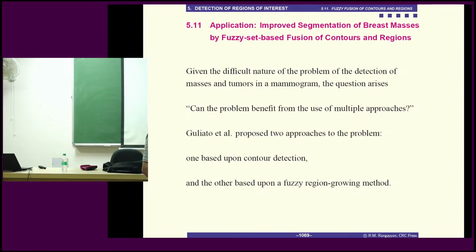No, but we were looking for straight lines only in the Hough transform case. In this case, we put other conditions that these lines must cross the upper boundary and the lower boundary. The lines that you get within the breast will be short lines, so they will all be rejected. I showed some of them that passed the test, but they will not be as strong as the pectoral muscle edge.